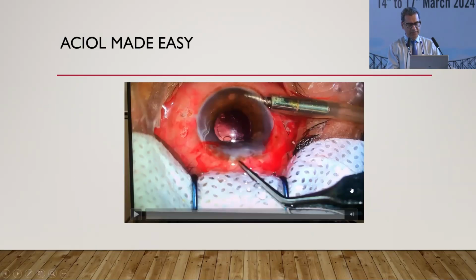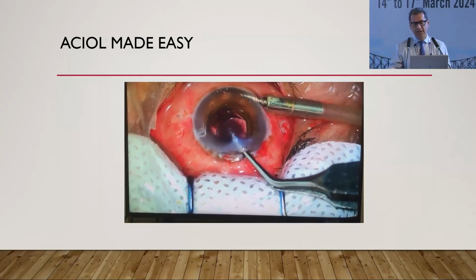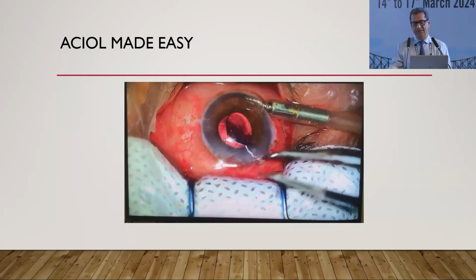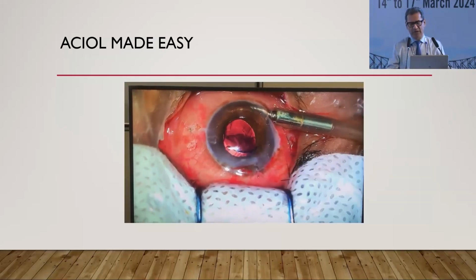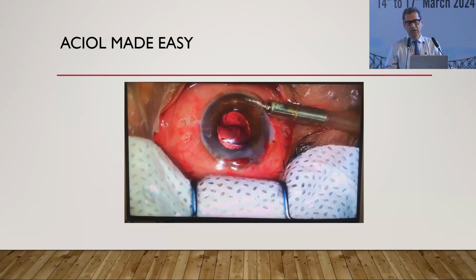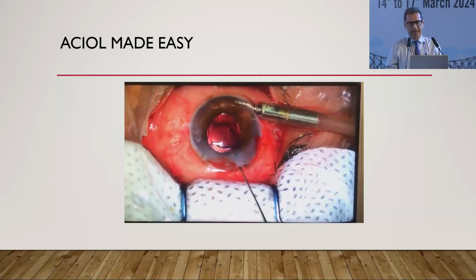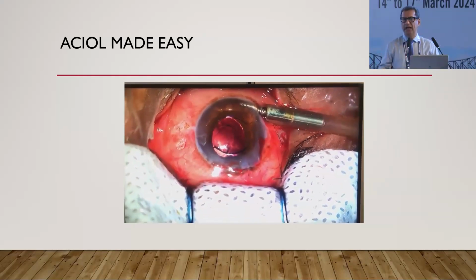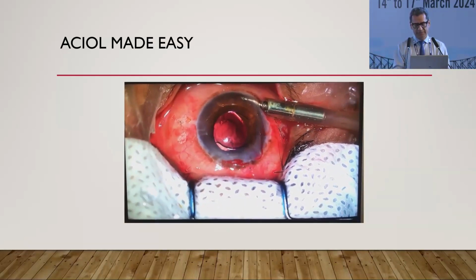This is again a brief video of AC IOLs. I just wanted to share with you all that this is the IOL to go to, which can be over in 5 minutes, and it gives very gratifying results. If you have done a good anterior vitrectomy, that is the main point I want to share with you all. And again, please use an infusion. If you're not safe with a pars plana infusion, please use an AC maintainer. And always dial the haptics by flexing them. You can't dial it how you dial a PC IOL in the sulcus. So we flex it and we dial it horizontally always.